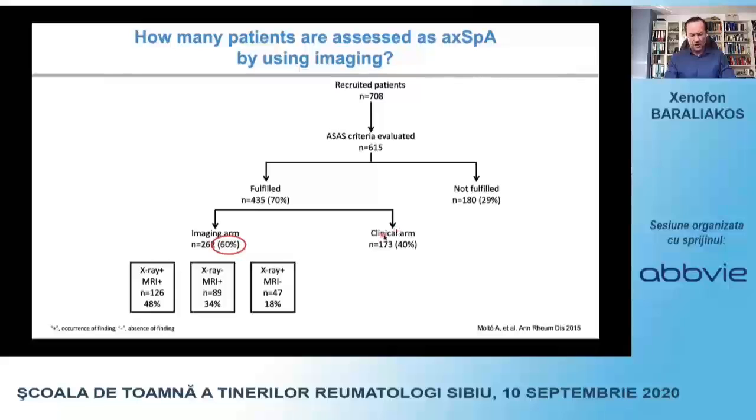And when they asked which kind of imaging they used for diagnosing their patients, they saw that the X-ray and the MRI in combination were used most frequently, 50%, but MRI throughout was used in more than 80% of the patients, or was taken into account as positive, which means that X-rays are still very important. And I do not say that we do not use X-rays in our hospital, but obviously we also need to be more sensitive and specific. You saw that before, and this is the world that we are living in right now. The usual suspects of MRI sequences, I will talk about sequences later, are the ones that are also being used in a broader context of a cohort and also in other countries.